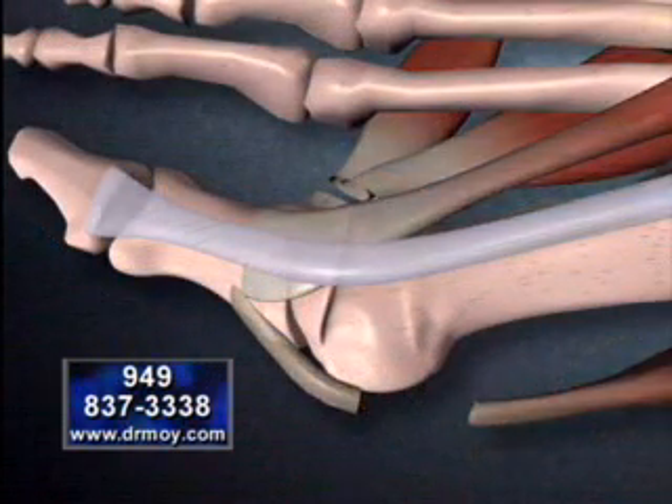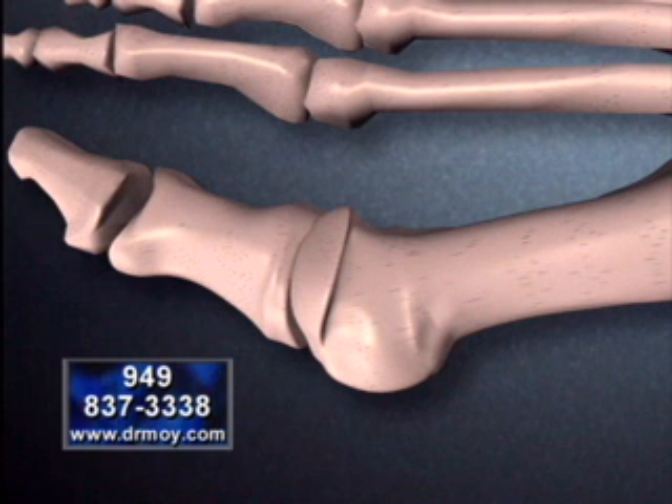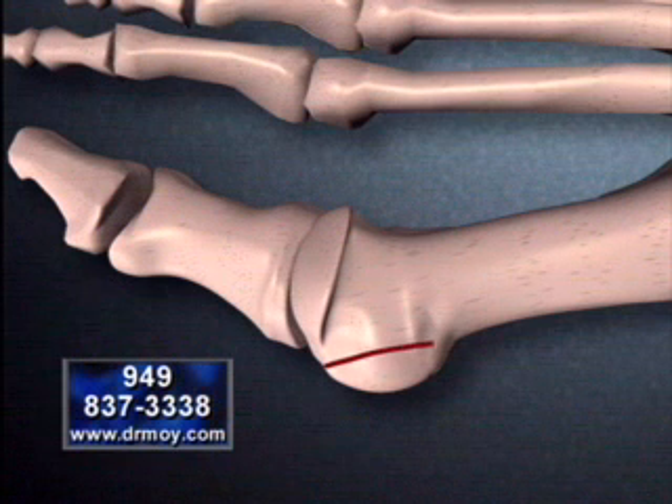As you see the tendons and muscles disappear, you can now appreciate the size of the abnormal bone growth. That abnormal bone growth, or bunion, is then removed.